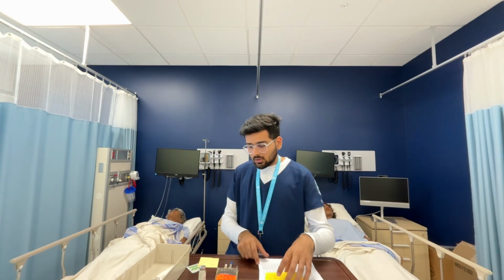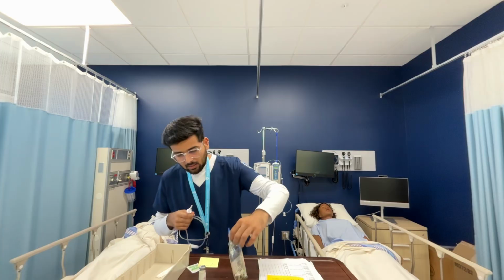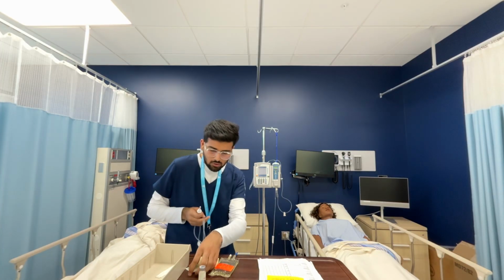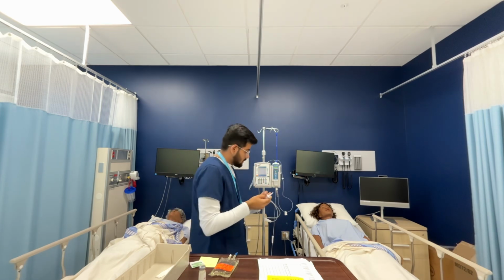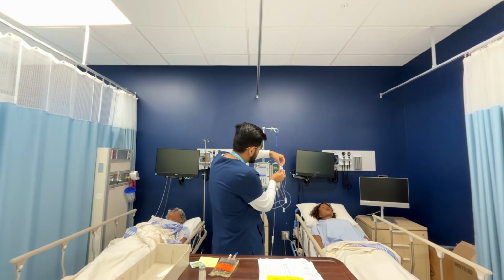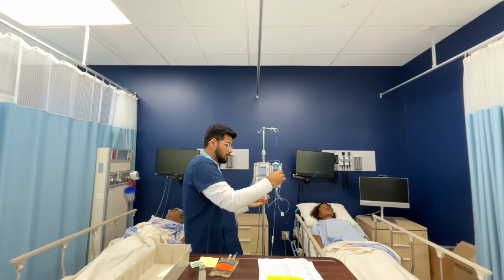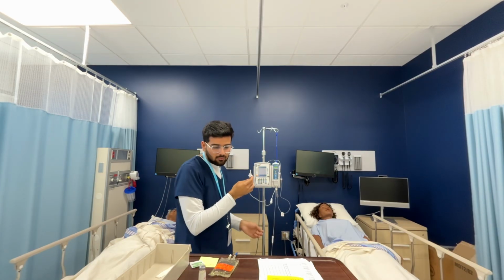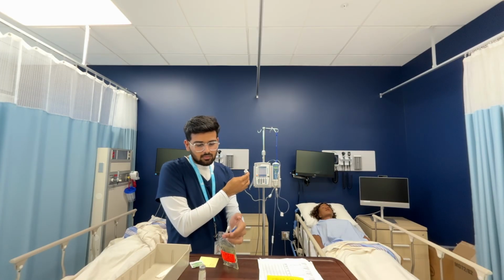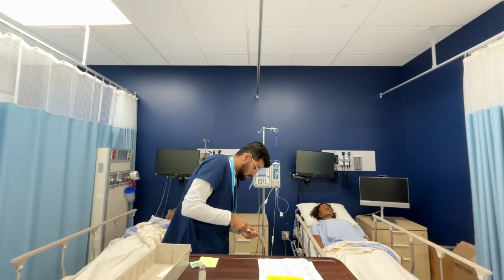Now she gave me consent, so I'm gonna grab my other supplies, my secondary tubing and my piggyback, and I'm gonna use my alcohol swab. I'm gonna clean it, and let it dry for a bit. I'm gonna inject this. I'm gonna do back priming. I'll make sure that this is still halfway through. This piggyback medication is brand new. I'm gonna open it. I'm gonna spike it slowly.